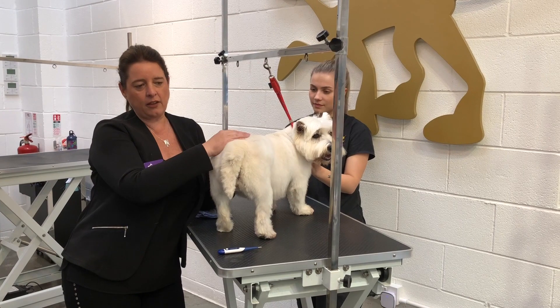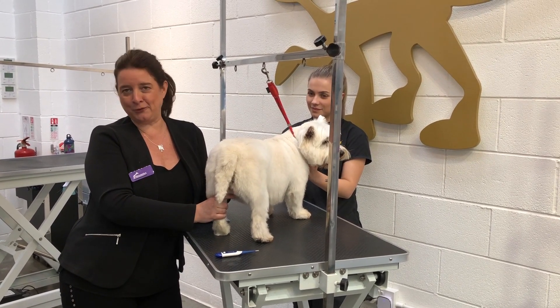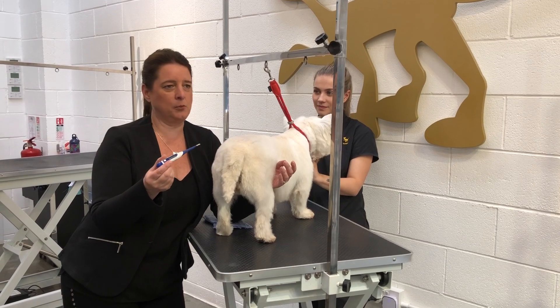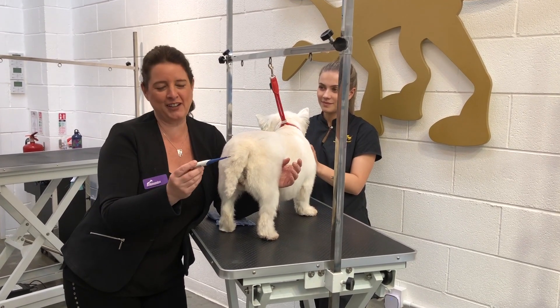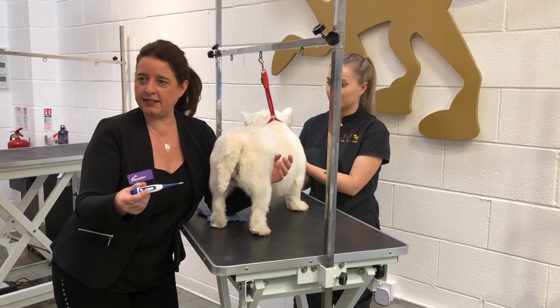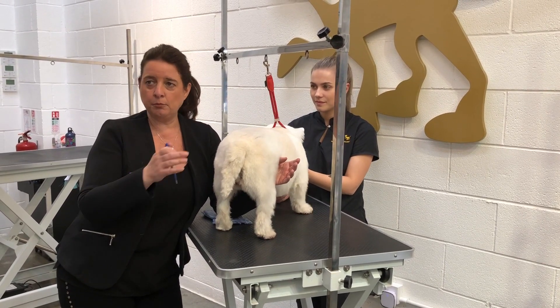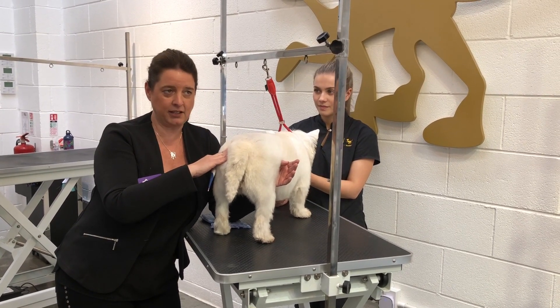That way you'll get used to how to locate the pulse of the dog, and secondly you'll get used to what a normal Labrador's pulse would feel like or what a normal West Highland White's pulse would feel like. That would then help you in an emergency situation to know if it's abnormal. So I'm going to go through temperature, pulse, and respiration with a normal dog, and I'll start with the one that everybody gets most upset about: rectal temperature taking. All we use is just a normal human thermometer, which you can get from any supermarket for about £3.99.